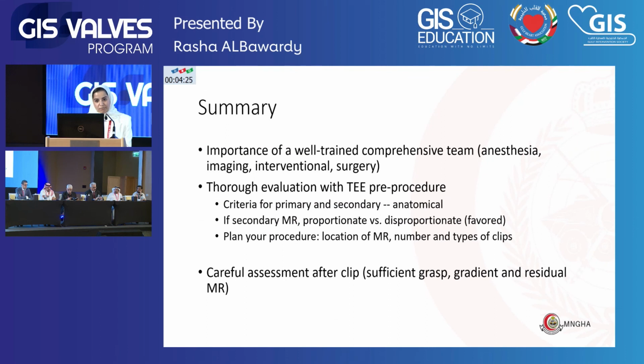So in summary, it is important to look at MitraClip as a whole. You need to have a really great team, not just the interventionalist. You need a great imaging specialist, you need an anesthesia team on board, you need a surgery team on board. So it's not a one-man show.